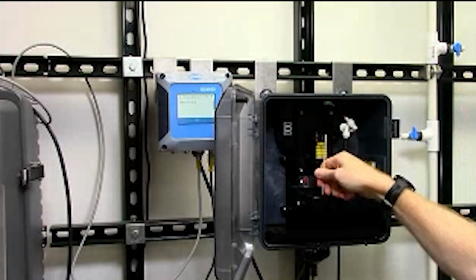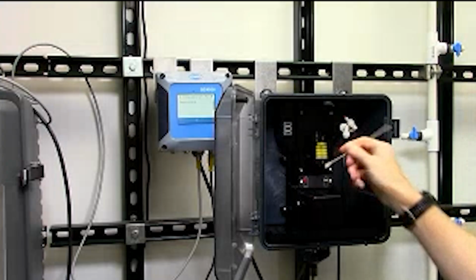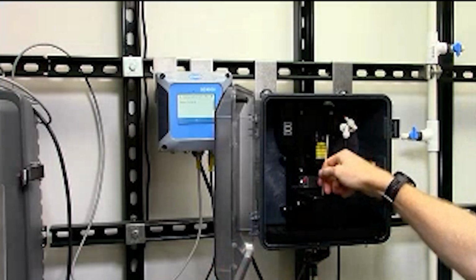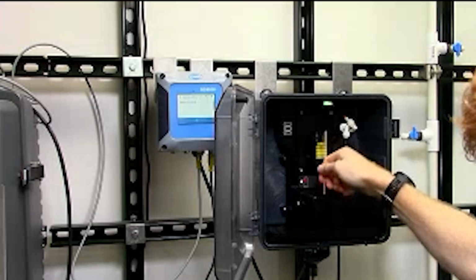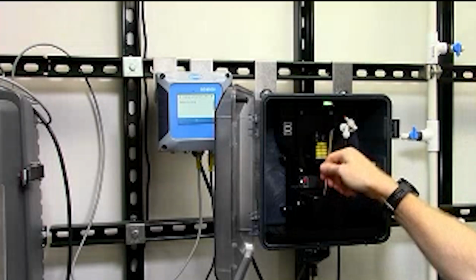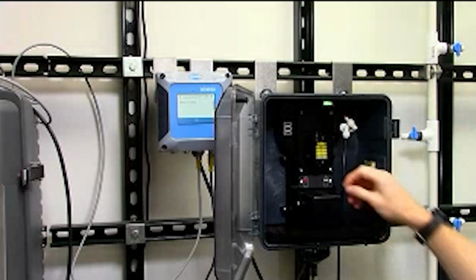corners and all four sides with my Q-tips. So Q-tips are still going to be around. I'm going to keep doing that with new Q-tips until I get a Q-tip that comes back that's no longer pink, purple, or black. And normally, in my experience, that can be anywhere from 3 to really 10 Q-tips. Who knows? It really depends how dirty, how long it's been.